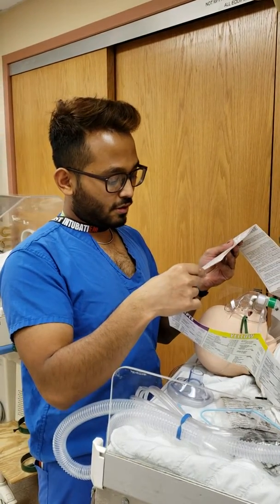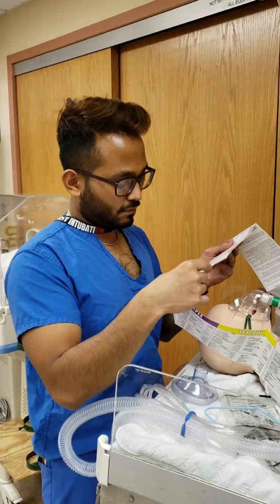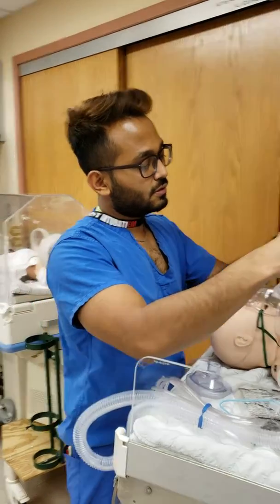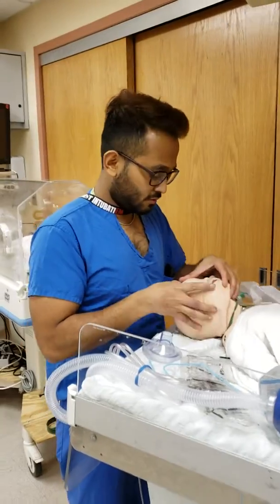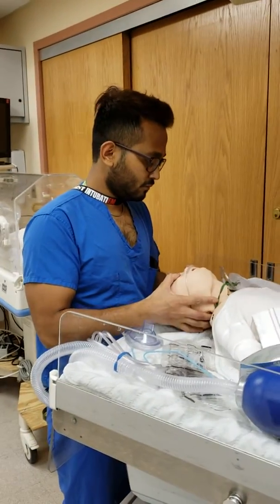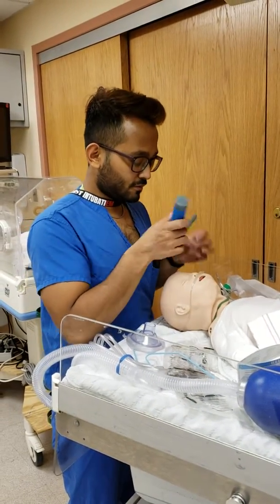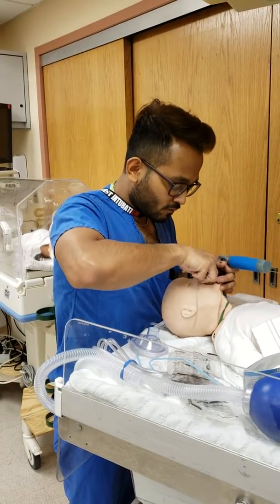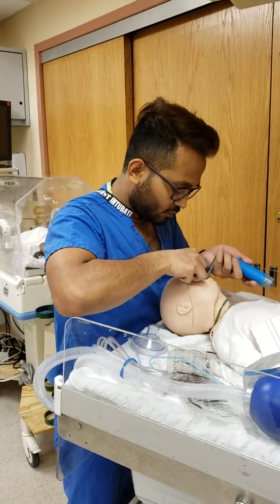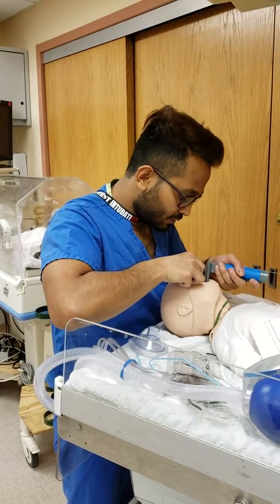I'm doing a 3-0 cuffed tube and my lip line will be 11 centimeters. We understand that this is just one part of the resuscitation — after we tube, or before we tube, we have to address why we're intubating. Is the patient getting admitted?